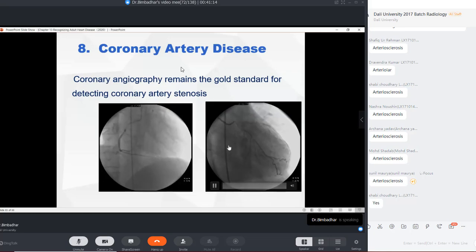I think generally you might have heard your uncles or whoever say that okay, we have done this angiography, we went down for doing angiography. Yes, if they must have been suffering from arteriosclerosis or coronary artery disease, this is the procedure that they do, and this is what the doctor is looking at to tell you how much blockage is there.